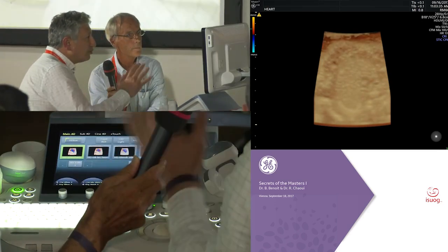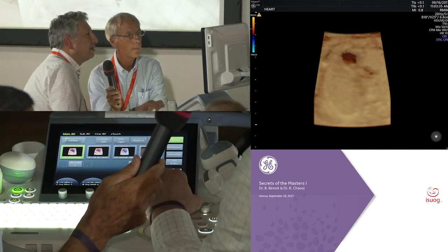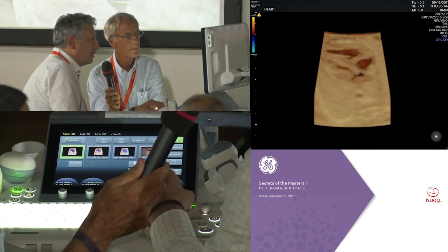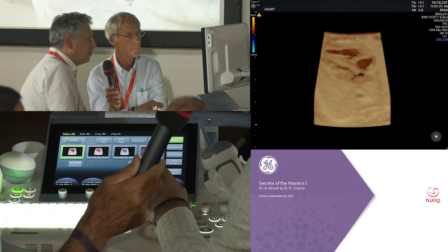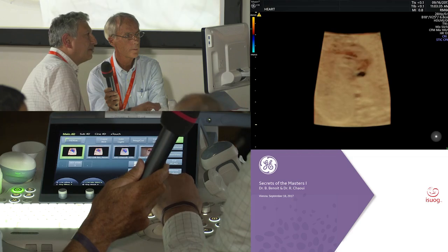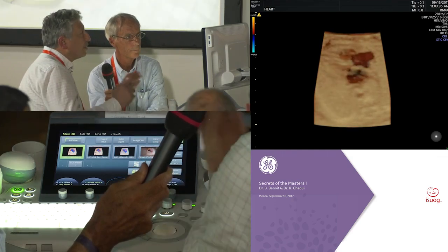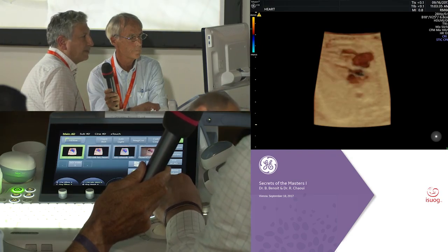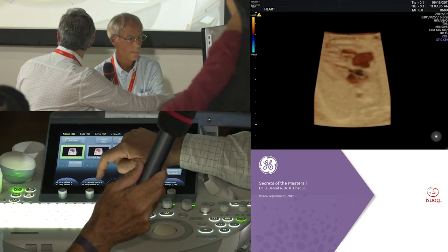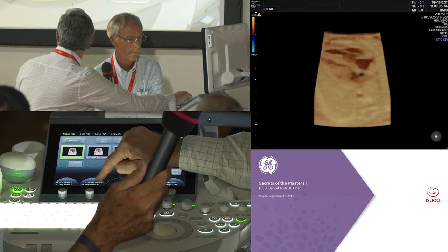I choose to remove all the color information, and I'm scrolling through the volume to demonstrate here the 4-chamber view. This is the 4-chamber with color information but not seen. And look at the button here. It is called mix of color flow mapping to grayscale. So it is 0 to 100%.